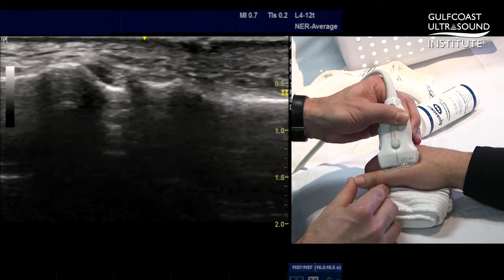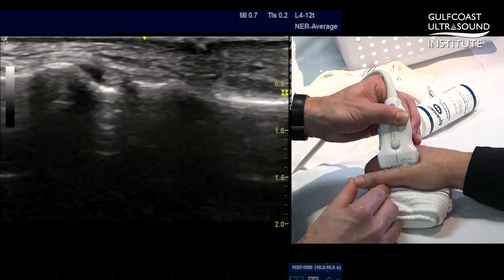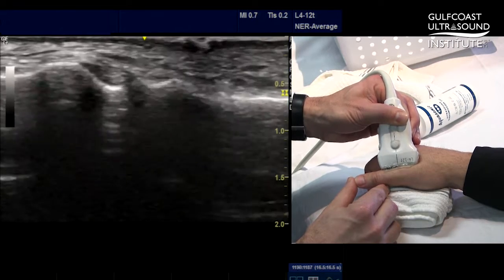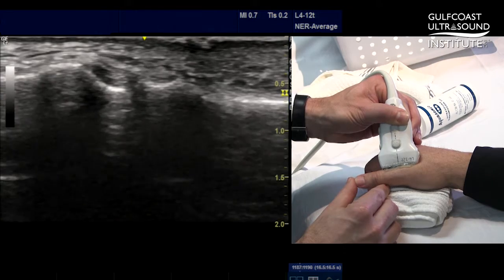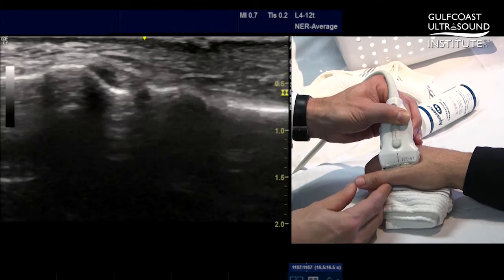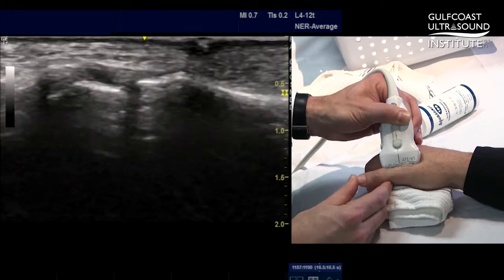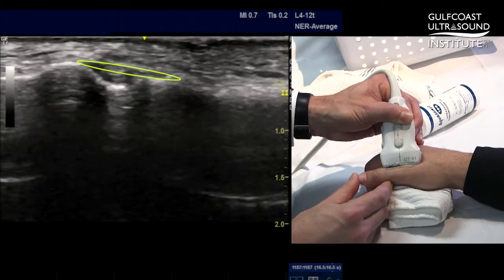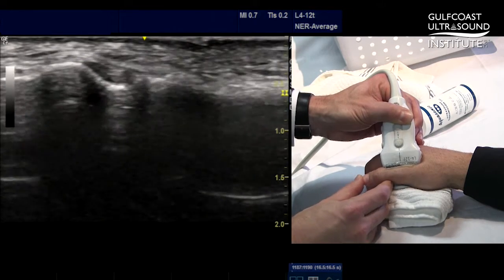Many times the ulnar collateral ligament will be slightly hypoechoic just due to the relative echogenic structures outside of that ligament. Another important structure to visualize is the overlying adductor aponeurosis. To identify that, we want to passively move the interphalangeal joint as shown here. When I am moving the thumb, you can see this thin hypoechoic structure which covers the ulnar collateral ligament sliding over the top.